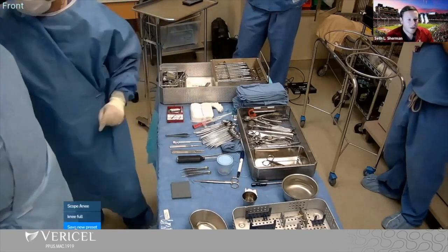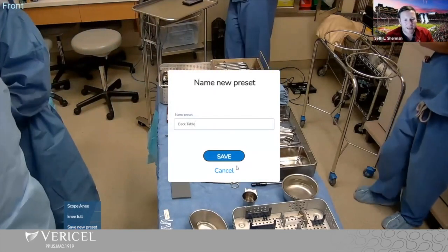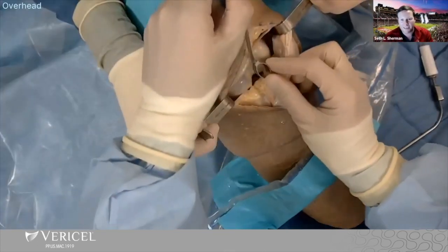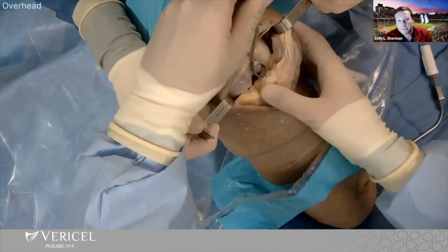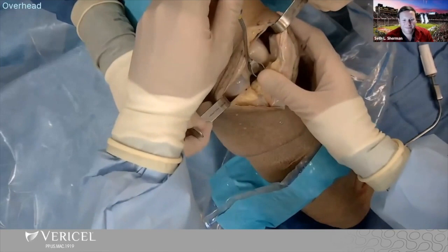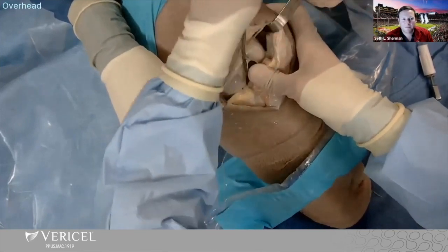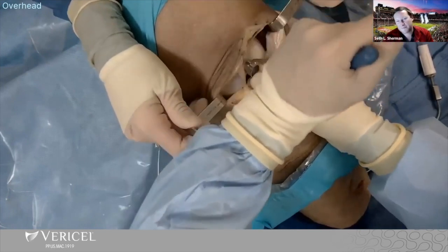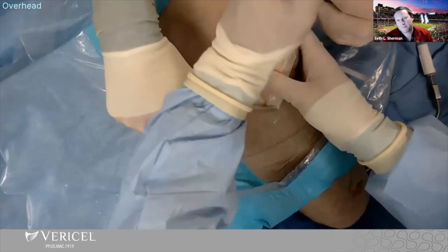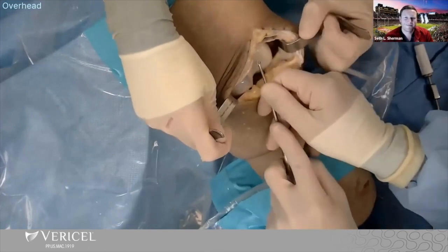Let's go back to the knee. We typically use Z-retractors, and I also like sharp 90-degree Homan retractors, which are outstanding for this work. The handles are nicely curved. I basically go onto the defect, lean in — there's a crunch, and that crunch is when you go right to the cartilage. Trochleas are really nice because you get a really deep bite. I rock it back and forth holding thumb pressure on there, and you get a really nice cutout.